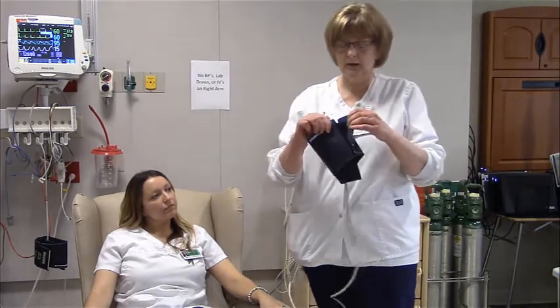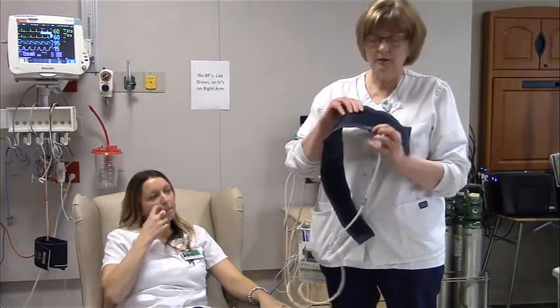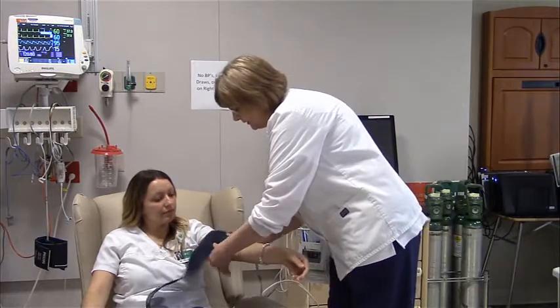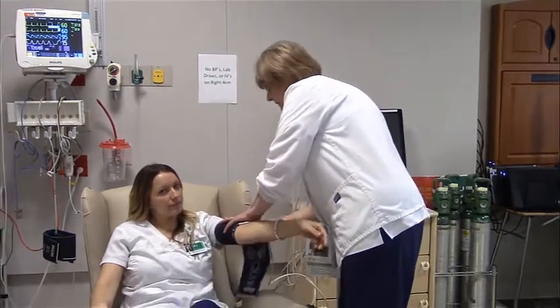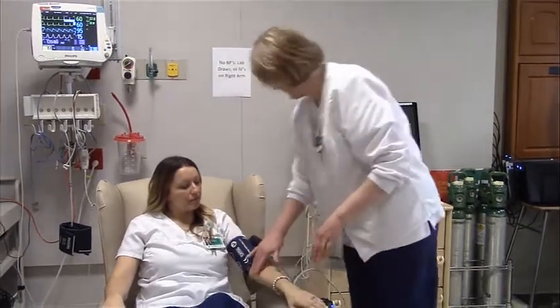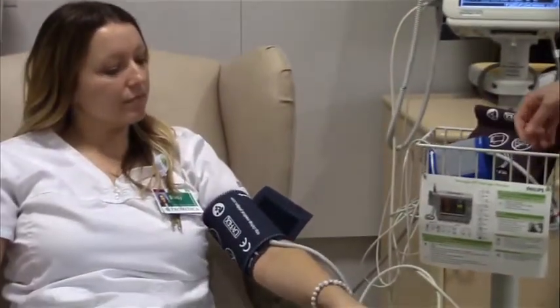It also has on it a little artery marker. This is what you're going to line up along your brachial artery. You want to have this on firmly but not too tight for your patient and above the actual pulse. Okay. You're going to turn that on to get it warmed up.